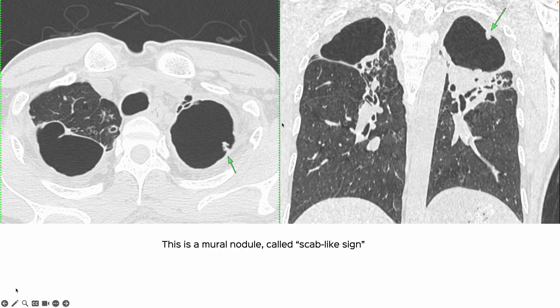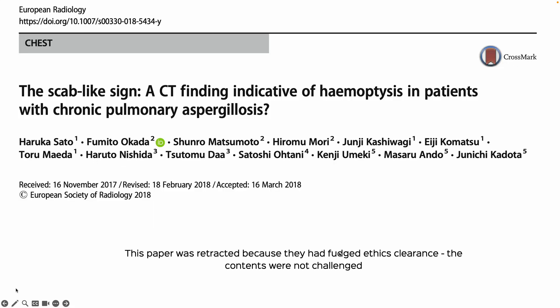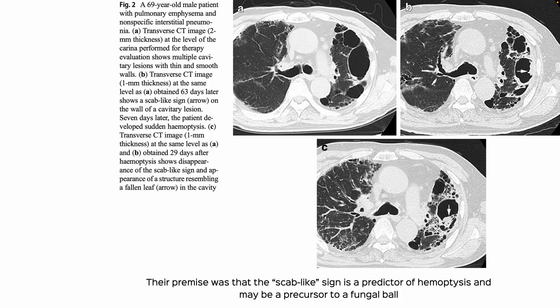This patient didn't have fungal balls, but if you notice, the patient has this mural nodule arising from the cavity. This is called the scab-like sign. It was first described — and it's the only paper that has described it — in 2018. The paper was later retracted because they had fudged ethics clearance, but the contents were not challenged.